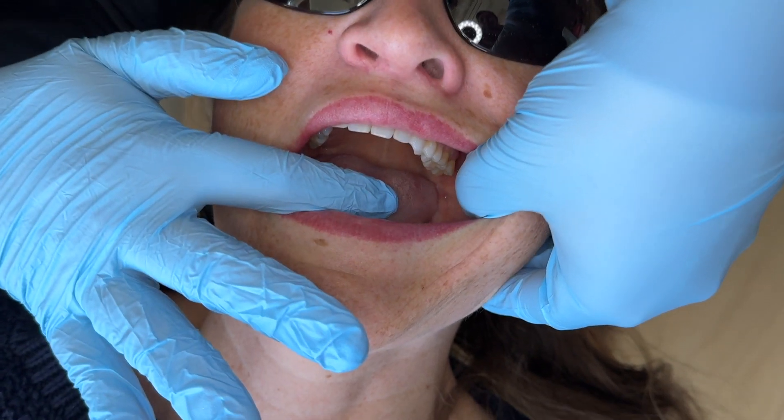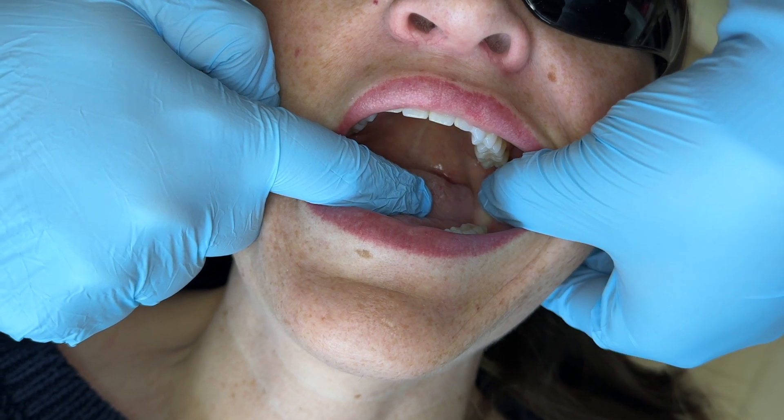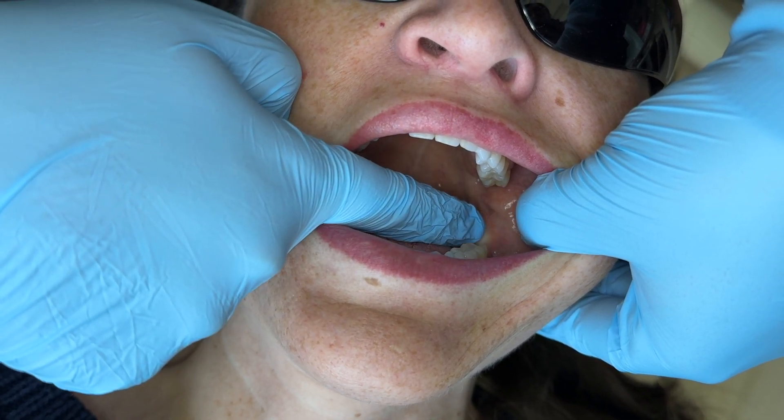When you find your location for your IA, there's two ways to do it. The first way is you can have the patient open super wide and pull that tissue really tight. Then you can actually see more of the anatomy back here.